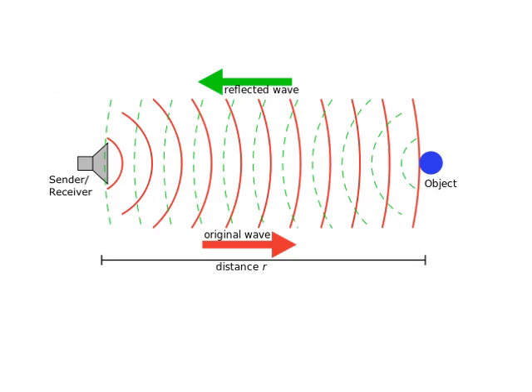So the sender and the receiver, this is the transducer. It sends out the sound waves and also picks up the reflected waves coming back. And this is the distance in here, and that's what the computer will be calculating, how far this is, so you can get an idea, a 3D idea of what's inside the body there.